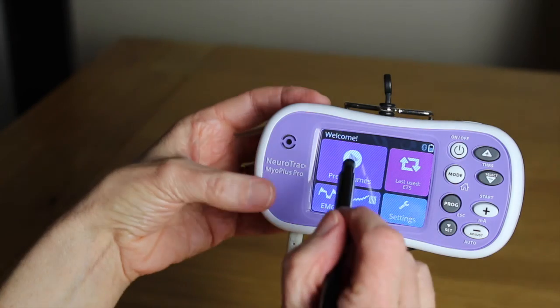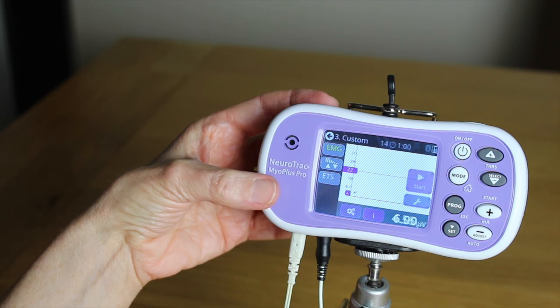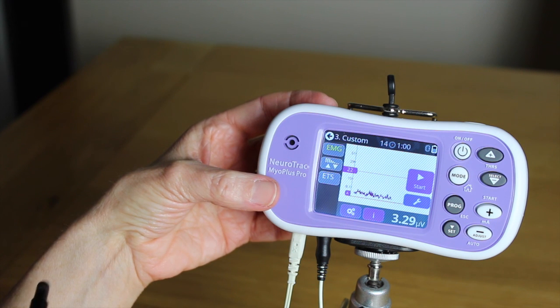You may want to add ETS to one of your customized programs, as set up in customized program number three. To summarize, the MyoPlus Pro is a versatile unit with many different functions. As with any device, we recommend it is used under the guidance of a healthcare professional. This ensures your condition is fully assessed and you are advised which programs are most suitable.